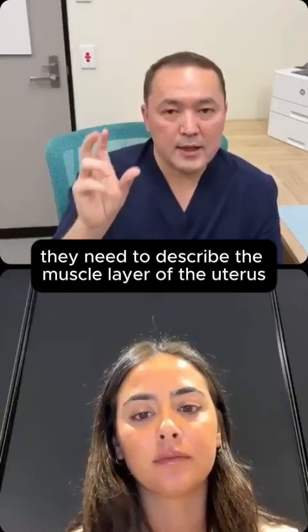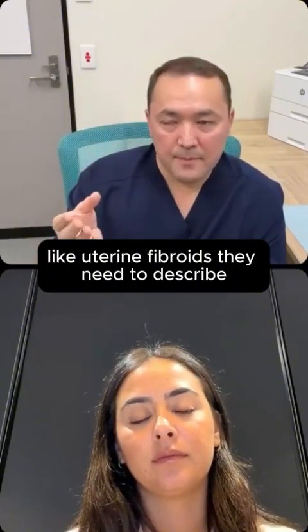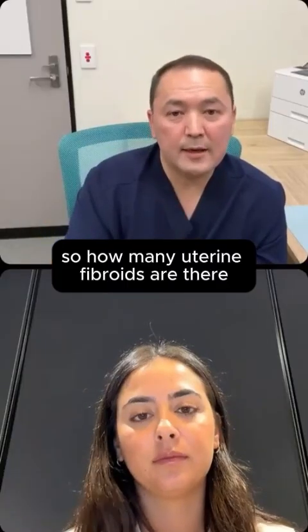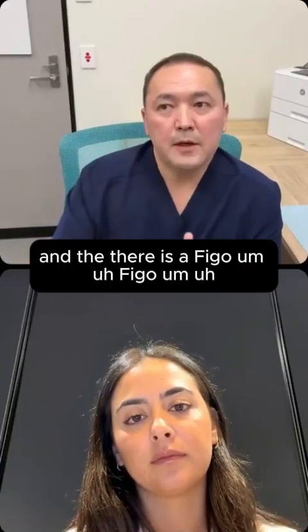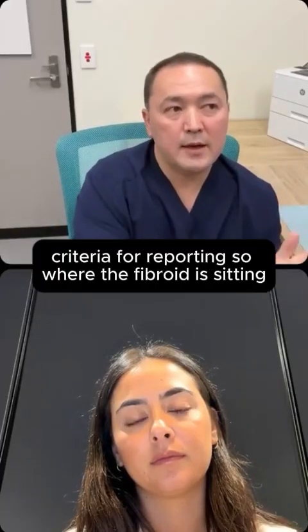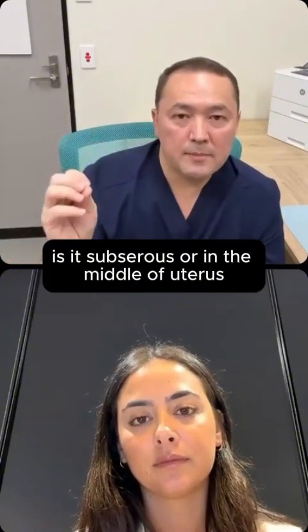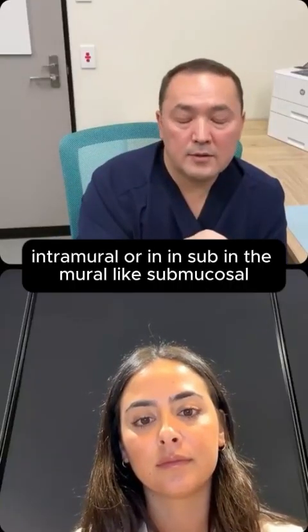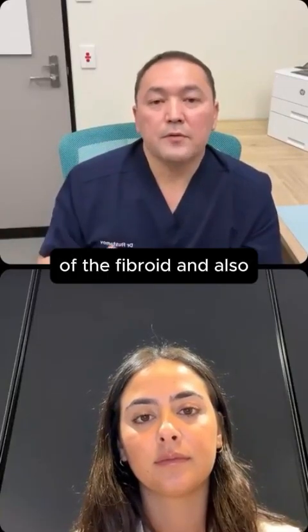Then systematically they need to describe the muscle layer of the uterus. That's the middle, thickest layer of the uterus. If there's any lesion in the muscle layer, like uterine fibroids, they need to describe it: how many uterine fibroids there are, the exact size of the fibroid, and the location of the fibroid. There is a FIGO criteria for reporting where the fibroid is sitting: is it subserous, in the middle of the uterus, intramural, or in the cavity, submucosal? So they have to describe the exact size and location of the fibroid.